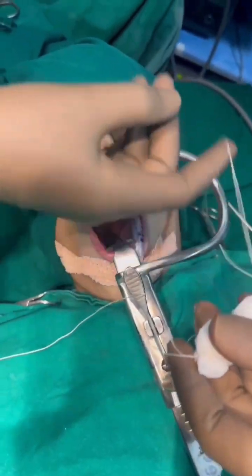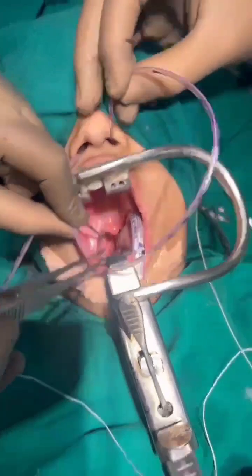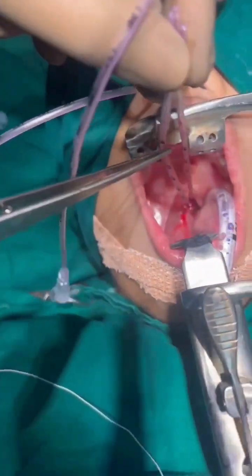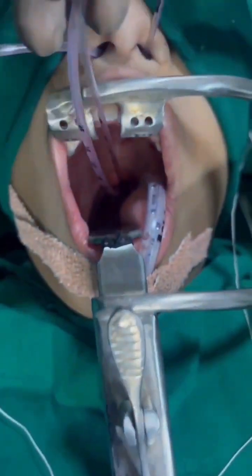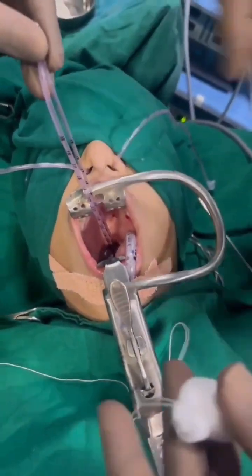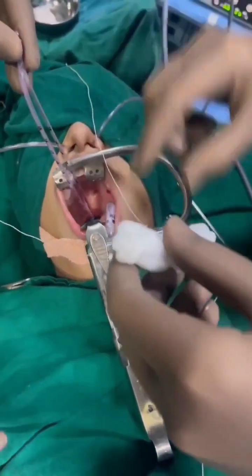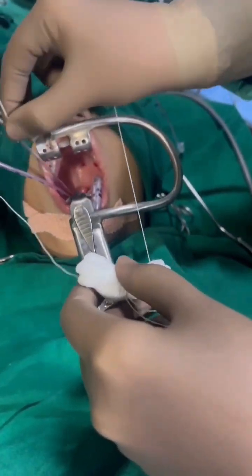We put two infant feeding tubes from the nose and they come out from the oropharynx, with the other ends pulled out from the mouth. Now we have two infant feeding tubes from both nostrils — two ends from each nostril and the other two ends from the mouth. The two side threads of the pack are tied to the end of each infant feeding tube.